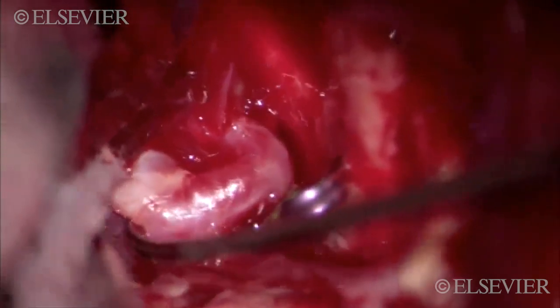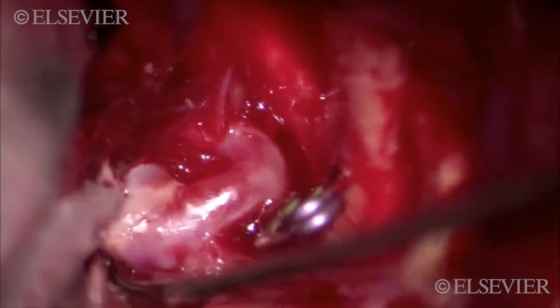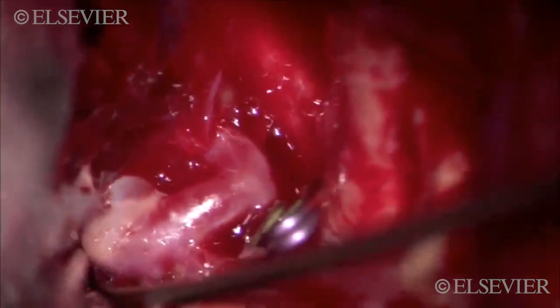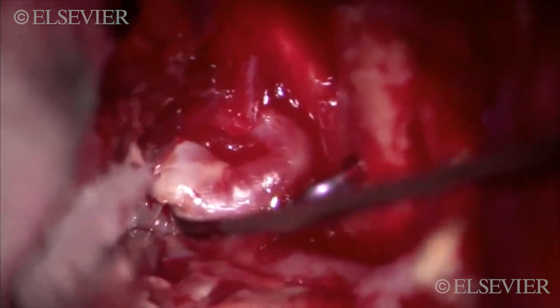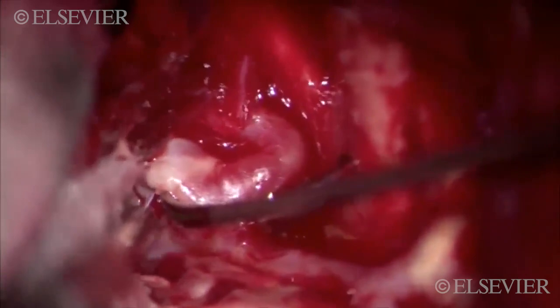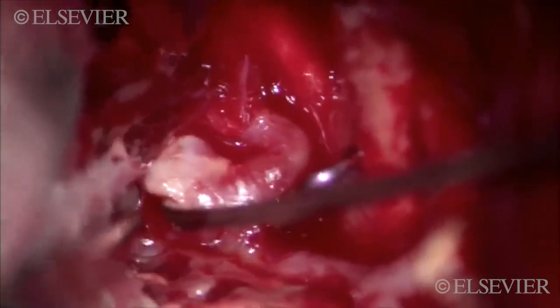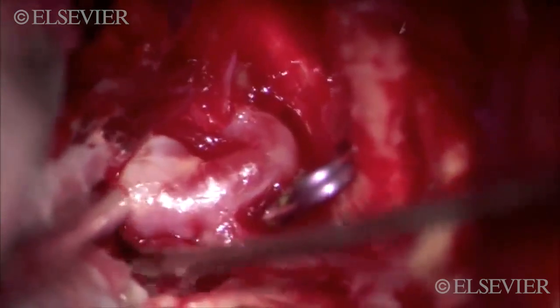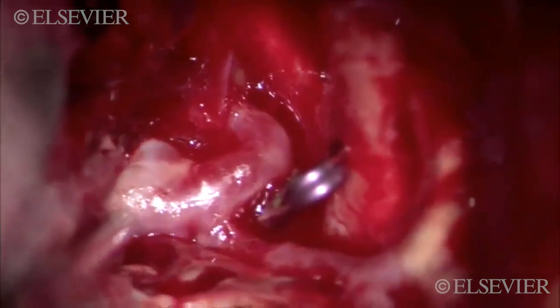There are a lot of adhesions, which are often seen in these dysplastic aneurysms, where it's stuck to the right A2, and an effort is being made to create a plane to introduce the clip. During this process, you will notice that there is an intraoperative rupture. However, it can be well controlled predominantly because one of the large A1s has already been clipped.